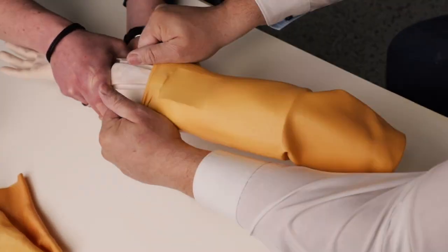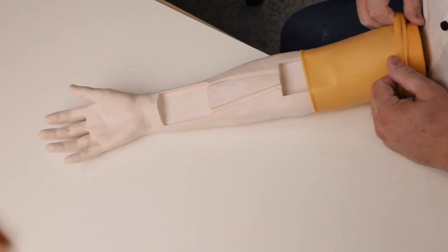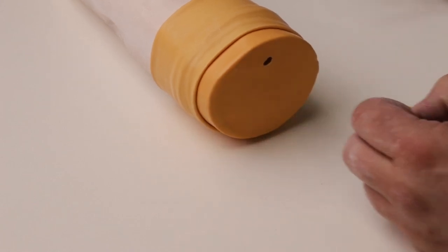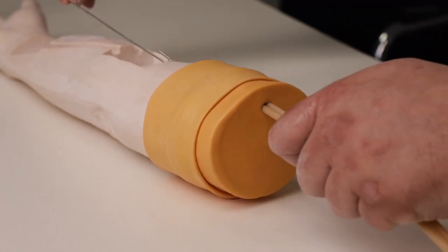Pull the skin over the arm and fold it backwards again. Cut holes for the vein tubes at the necessary places. Use the supply tool to pull the veins through the holes.